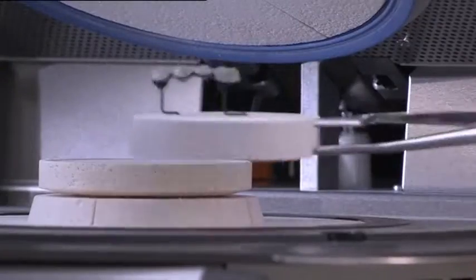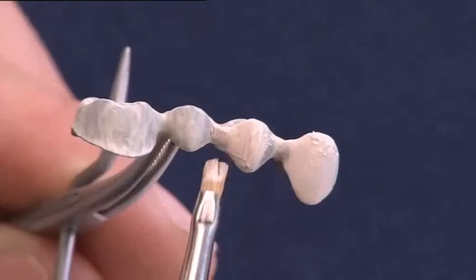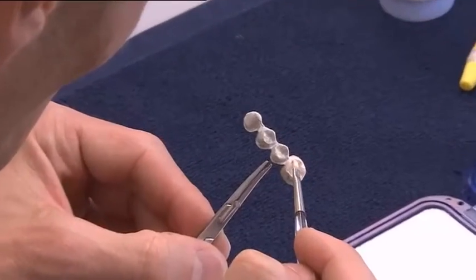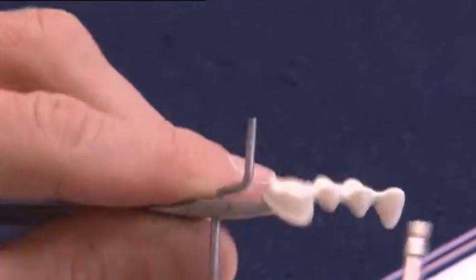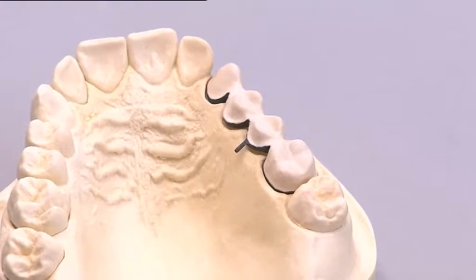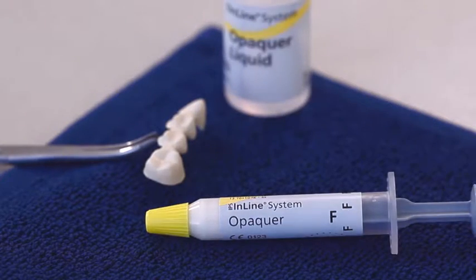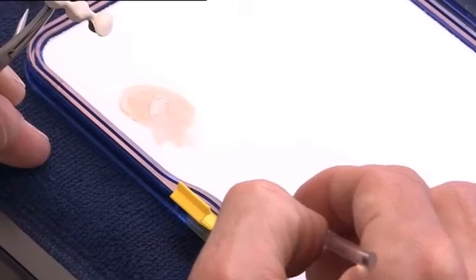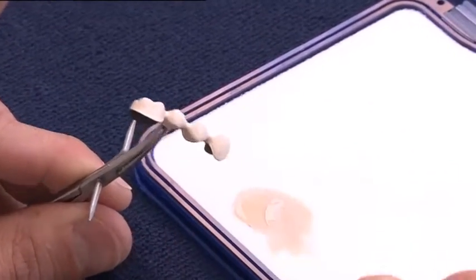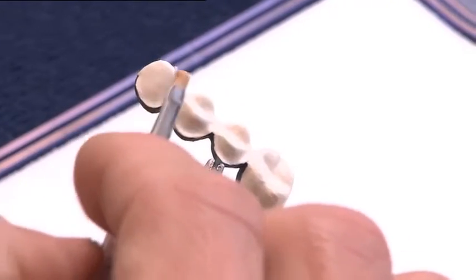The second opaquer layer is applied in such a way that the framework is completely covered. For a characterization of the opaquer layer, intensive opaquers may be used. After firing, the opaquer should demonstrate a silky matte gloss. For enhanced in-depth fluorescence, the opaquer F can be used. Either apply the opaquer F as a thin third opaquer layer and fire, or mix up to 20% of opaquer F with the conventional opaquer before the second layer is applied.